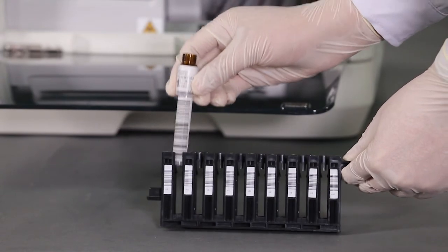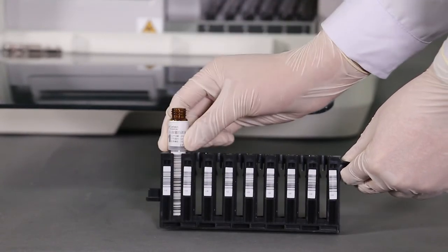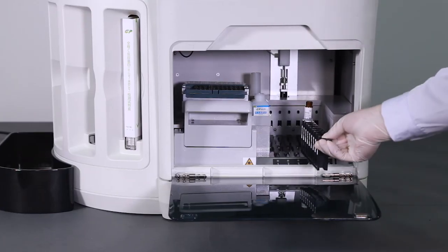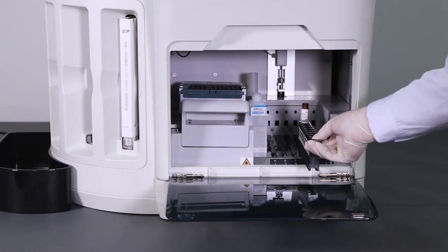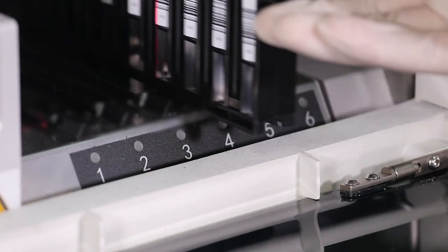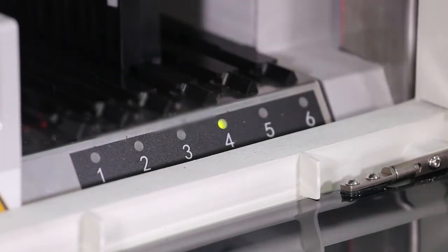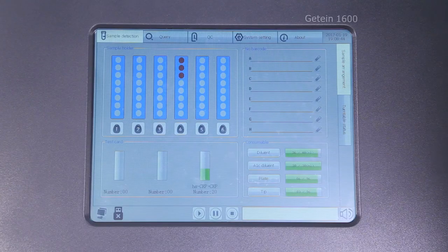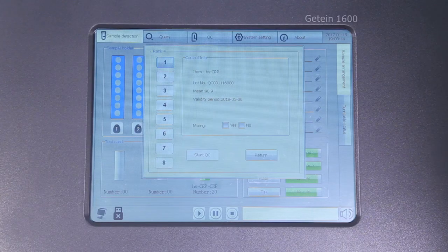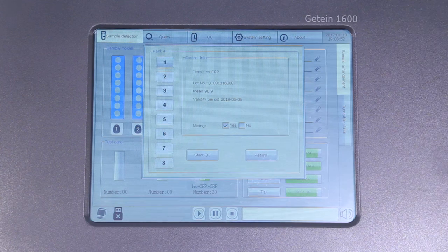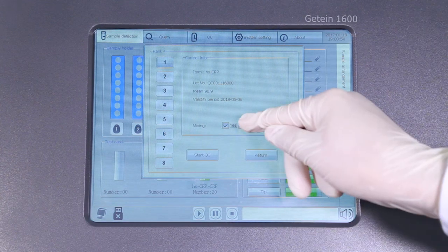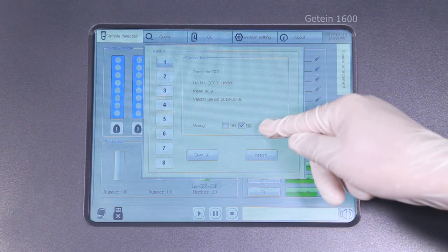The instrument will scan corresponding barcode, which contains detailed information of the controls. Please check the information and click Start QC to do the calibration automatically.